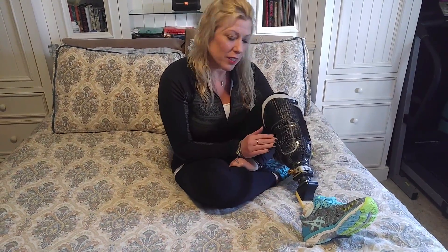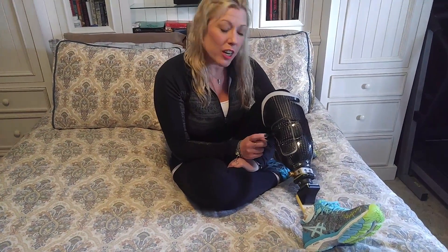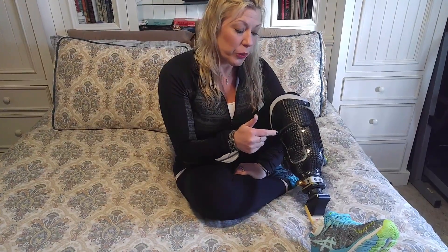Good afternoon everyone. I just wanted to check in with you guys and let you see Black Betty. She got a total makeover and major facelift and I'm loving her — she's good to me and she's helping me get around really, really well. So today I just wanted to show you and explain how my socket works.